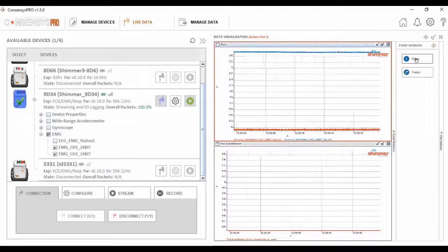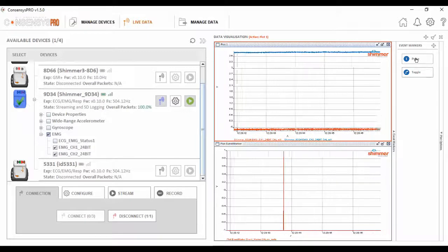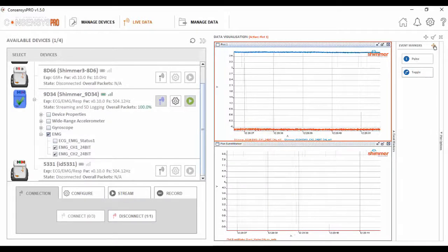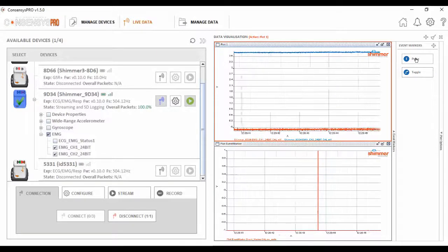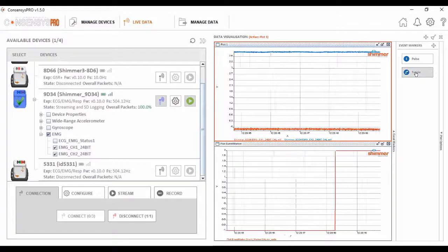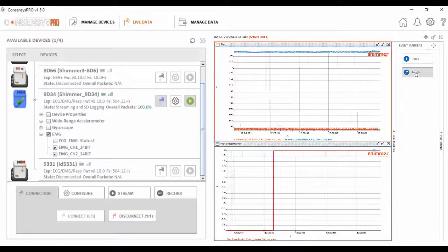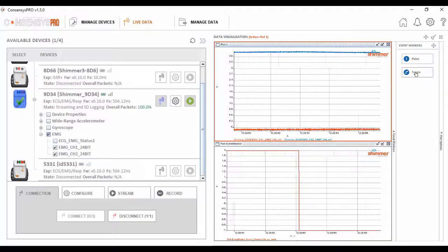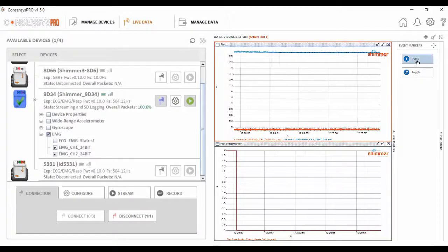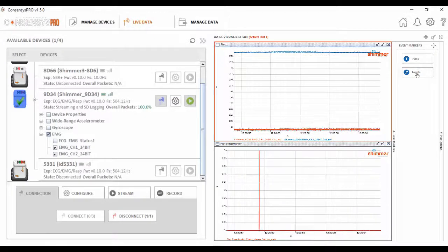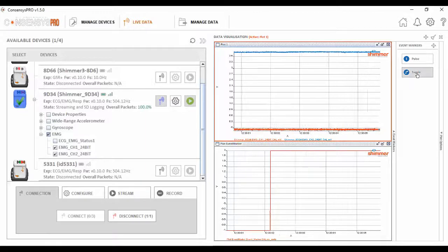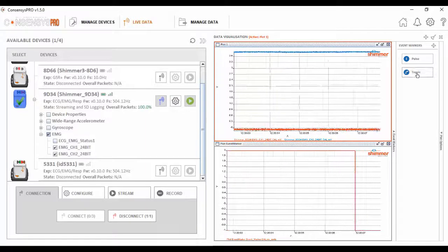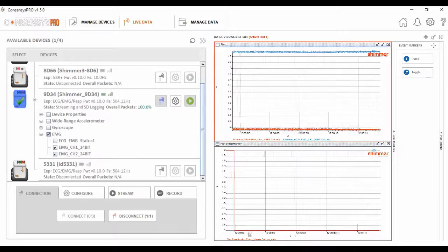Another option when recording live data is to add event markers to highlight moments of interest. You can add the event marker here. There are two types of event markers. The pulse adds a single marker to the data, while toggle sets the event marker over periods that is defined by the user pressing, starting, and stopping the toggle event marker. I'll show a couple of examples here. The pulse is a single marker, as you can see, while the toggle is defined by start-stop. These event markers are time correlated with the data you're currently recording.